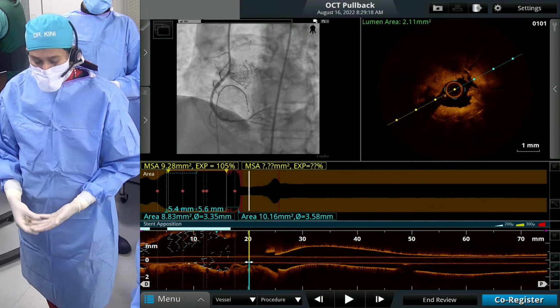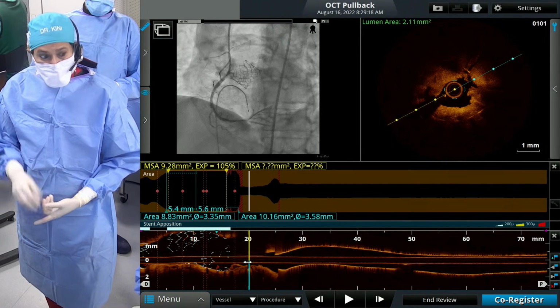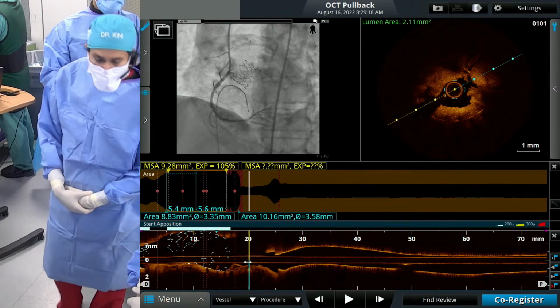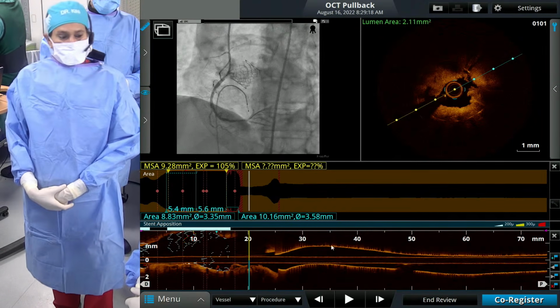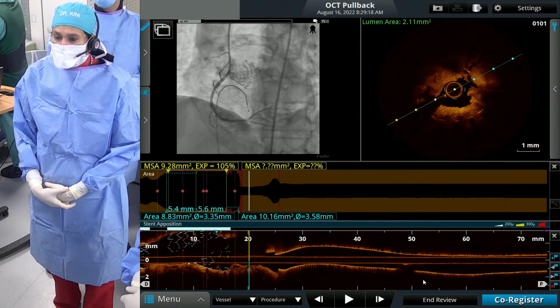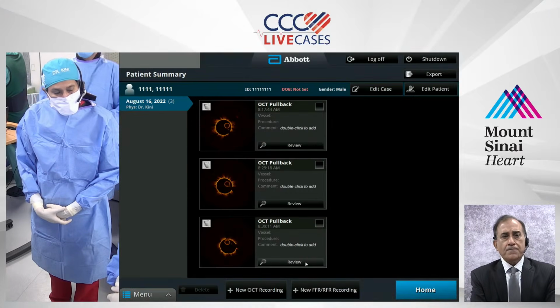So any of this is possible. If there was calcium inside the stent, outside the stent, definitely rotational atherectomy. Outside, I think IVL would have been a better choice, since we know that penetration would have been deeper. Right. And under expanded stent, we learned quite a bit today.